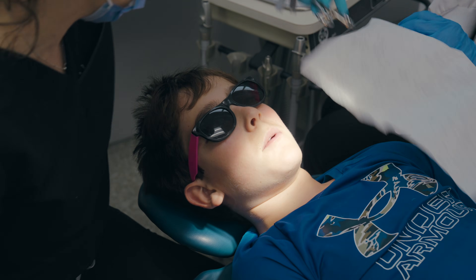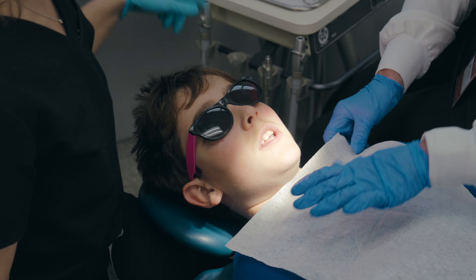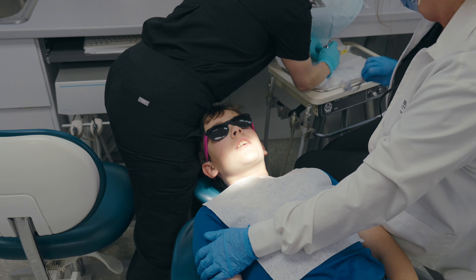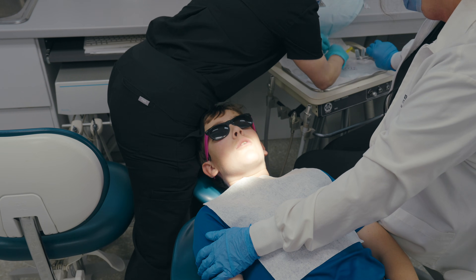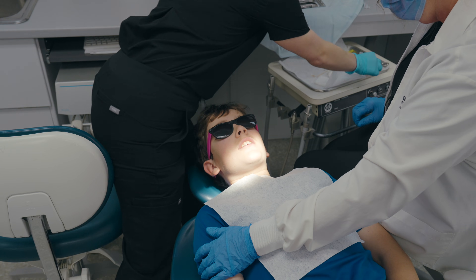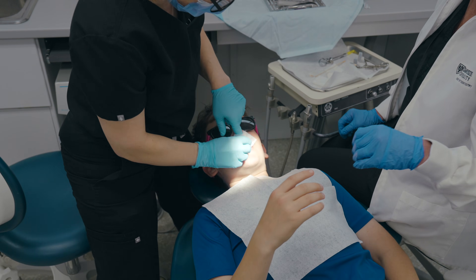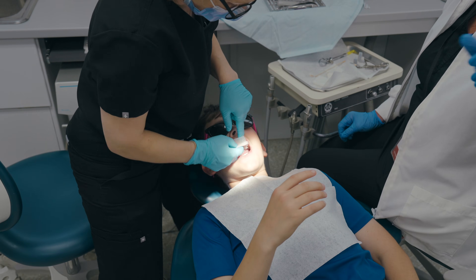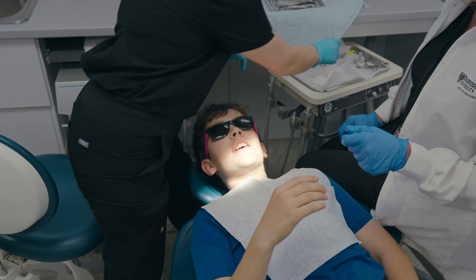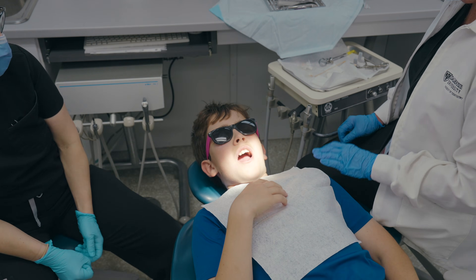You may have to remind the patient to keep their hands down and under their bottom. Your assistant should be instructed to place a supportive arm over the patient in case the patient were to raise their arm suddenly. Sudden patient movement without proper patient stabilization can be unsafe for both patient and operator.